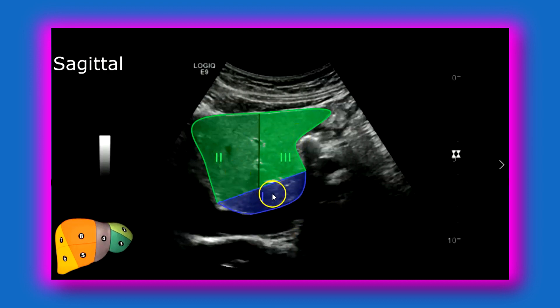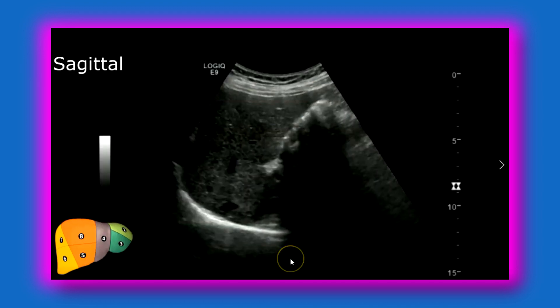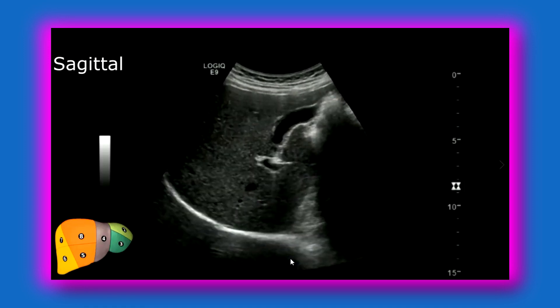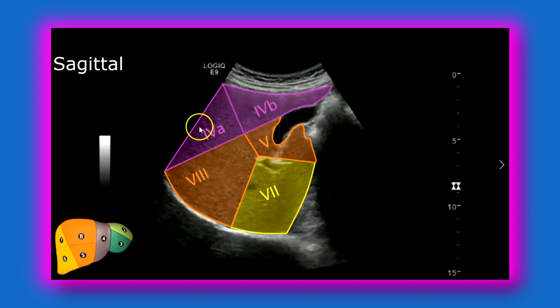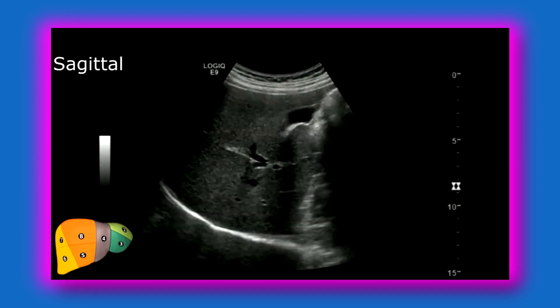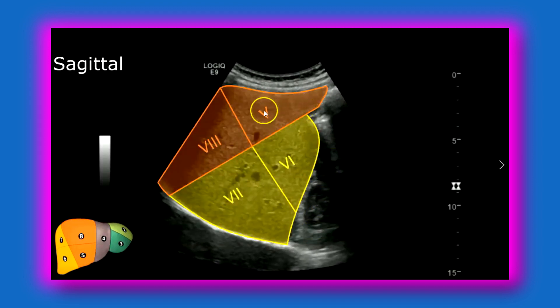Segment 1 is the caudate lobe. Moving to segment 4 — you have a little bit of gallbladder right there, and here's your portal vein plane: segment 4B, 4A, 5, 8, and 7. Moving further laterally, you're starting to get a little bit of kidney, so segments 5, 8, 6, and 7.